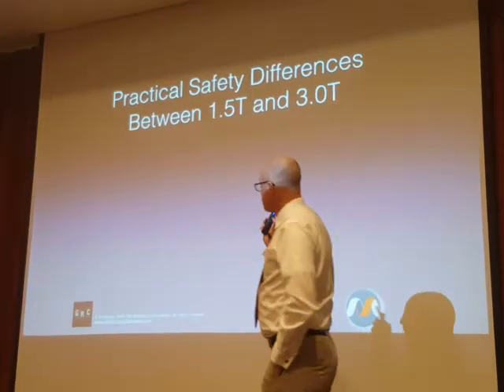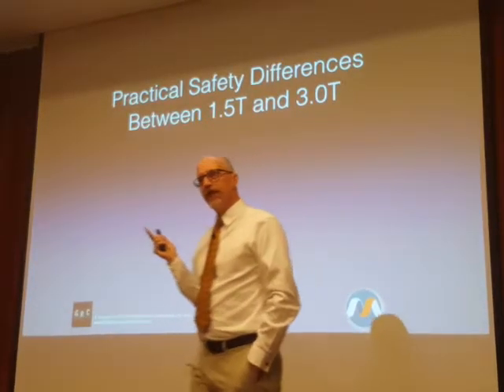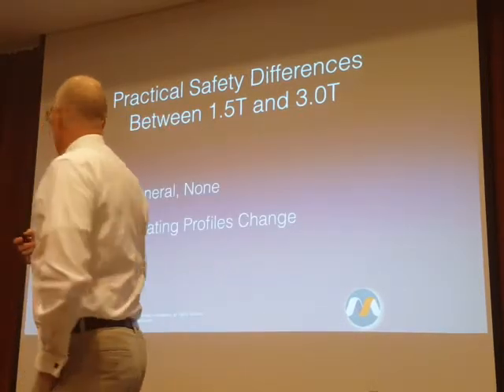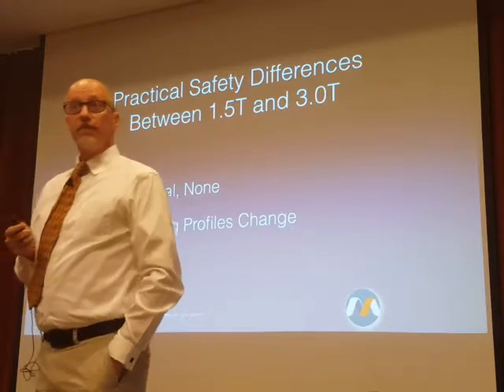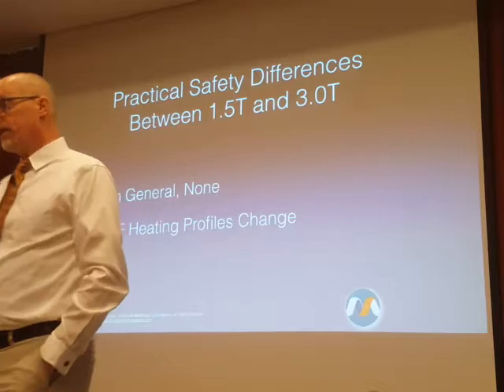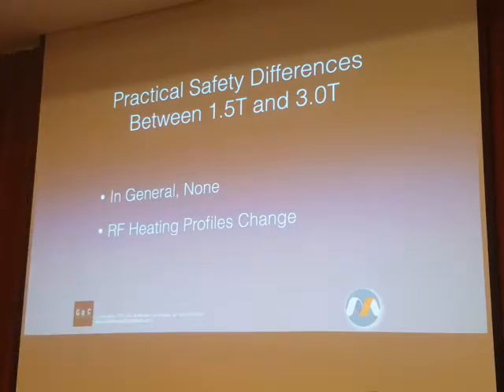Before we get to that though, the practical differences between 1.5 Tesla and 3 Tesla when it comes to MR safety. None, from an operational standpoint. In terms of what you should be doing in terms of basic screening of your patients, of hospital employees who come into the environment, MR safety training, access restrictions, 4-zone environments, those sorts of things. It really should not matter whether you're talking about 1.5 Tesla or 3 Tesla.